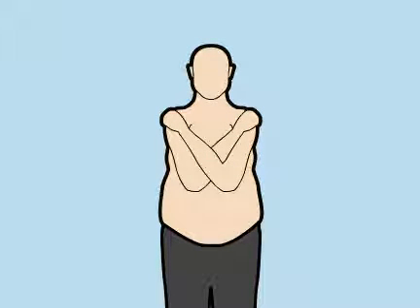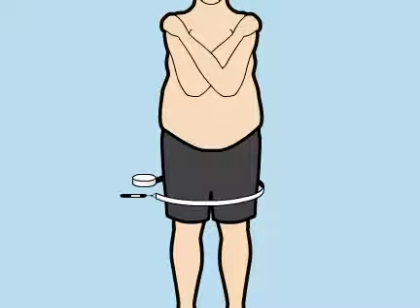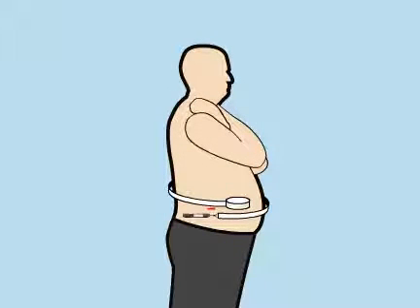Step 6. To work comfortably around your patient, you may choose to wrap the tape around their legs and then move it up. Place the measuring tape horizontally around the patient's abdomen. Keep the tape horizontal from left to right and from back to front. A mirror is recommended to facilitate this procedure.